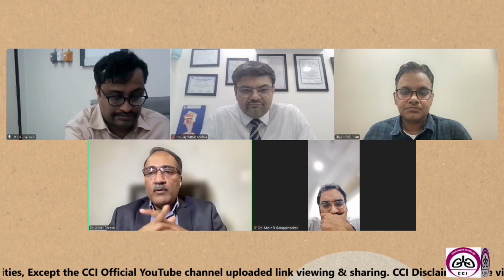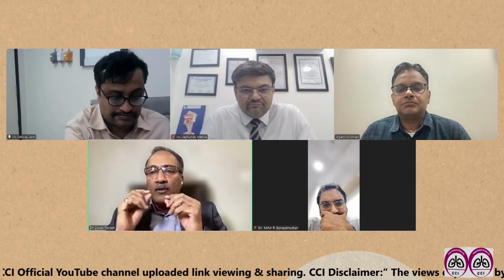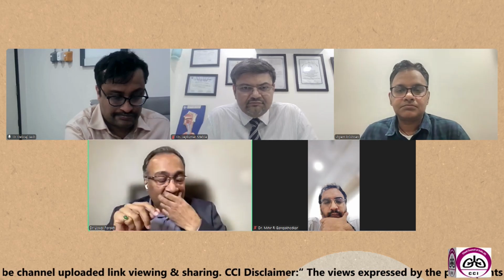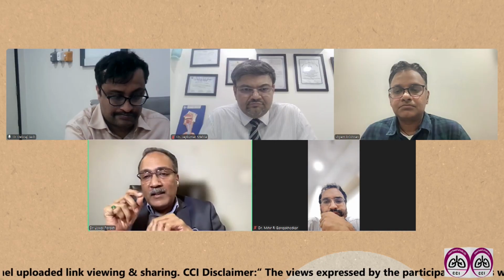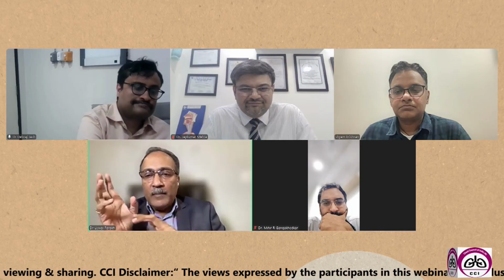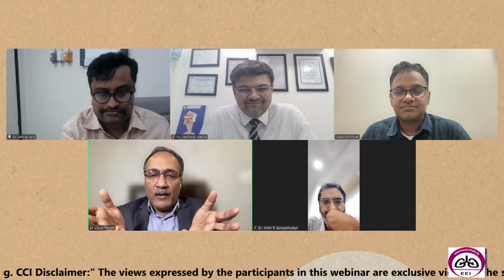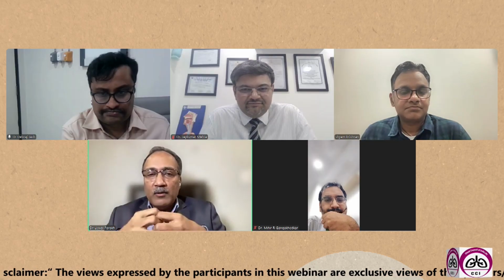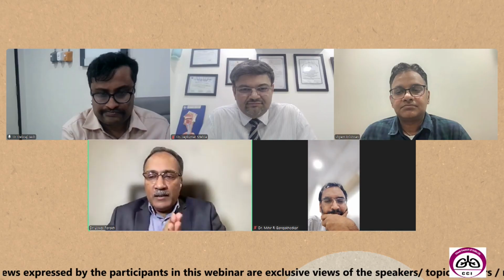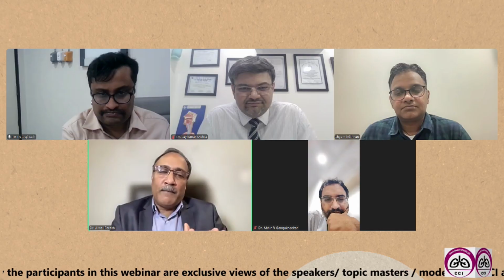But the problem with ROSE is not this only. The problem with ROSE is that at times, when you're dealing especially with smaller nodes and doing staging, you may feel that this is enough. But when you send it to the pathologist, they say, no, we're not seeing this. It is not enough. So at times, ROSE may not help. You still have to do your procedure completely. If you have to take 4 or 5 passes, you have to take 4 or 5 passes from there.